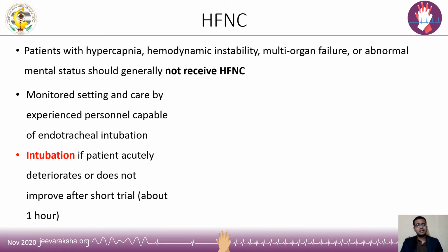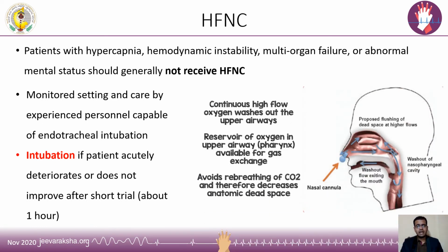So what is this high flow nasal cannula? The oxygen is given in a high flow, as the terminology says, it is given in a continuous high flow. Because the air is enriched with oxygen and given in a high flow, most of the upper airway, which acts like a dead space, what we call the anatomical dead space, is replaced by oxygen. Usually it has oxygen and carbon dioxide, but because of the high flow which is generated, this is completely replaced by oxygen. So this will act like a natural reservoir to the patient.